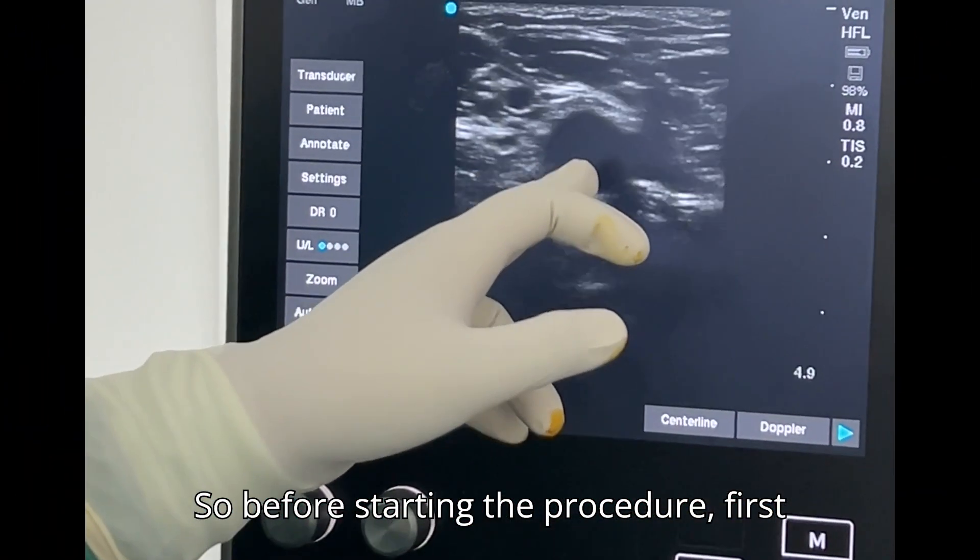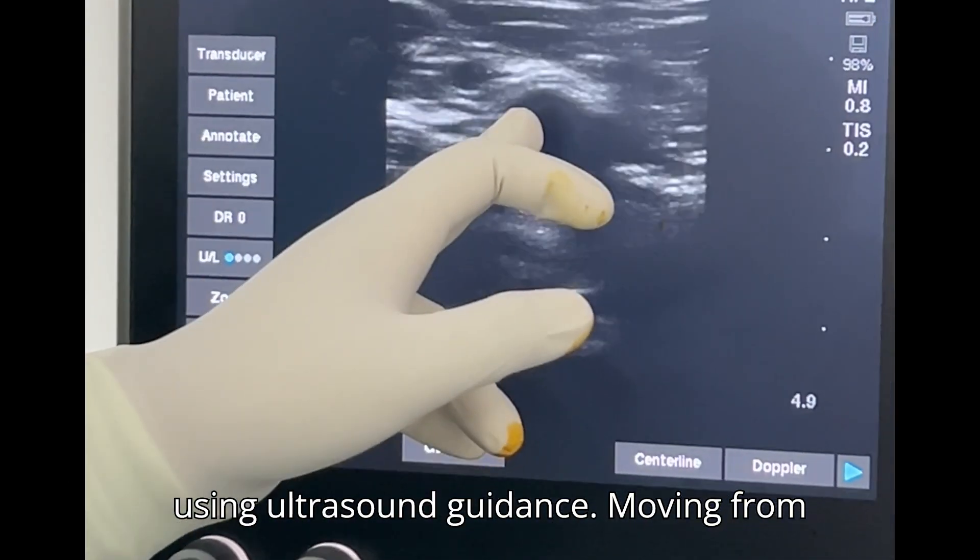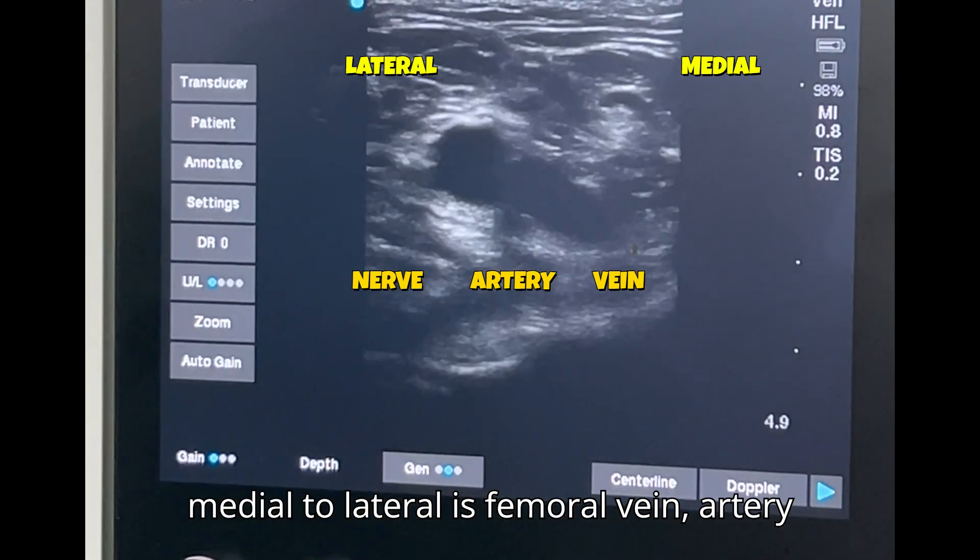Before starting the procedure, first visualize the anatomy of the patient using ultrasound guidance. Moving from medial to lateral is femoral vein, artery and nerve.